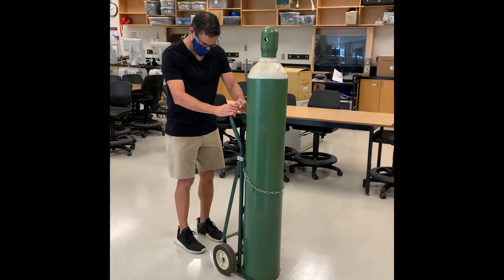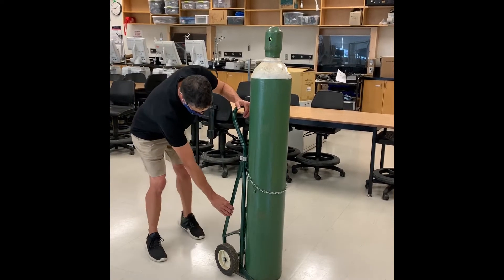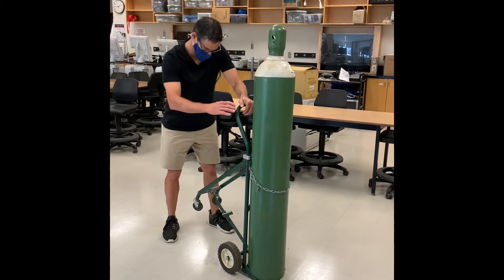Respiratory therapists may need to move medical gas cylinders, and we have to be able to do so safely. Remember, they have lots of pressure inside of them, so if they were to fall over, they could cause serious damage to someone. What you're going to see here is moving a T-size cylinder, which is slightly bigger than an H-size cylinder.